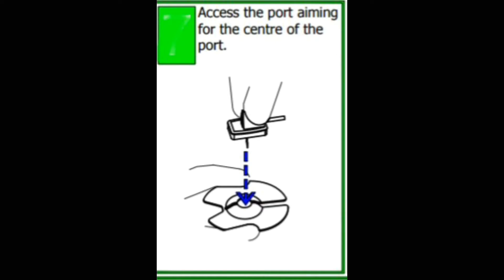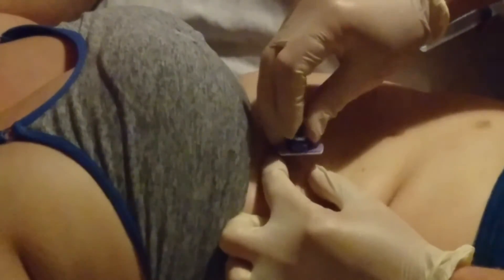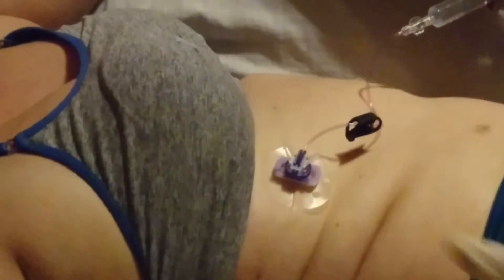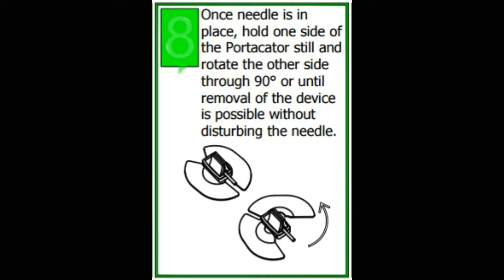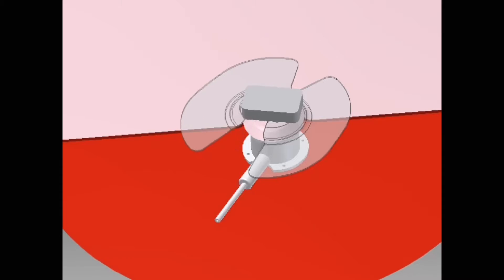Now you're ready to access the port, aiming the needle into the centre of the dome. The hinged edge opens to allow you to slide the device away without disrupting the needle.